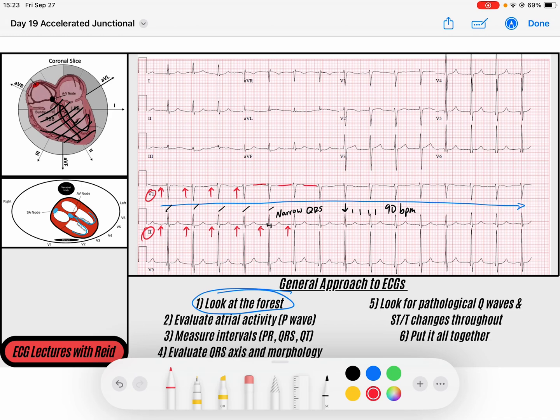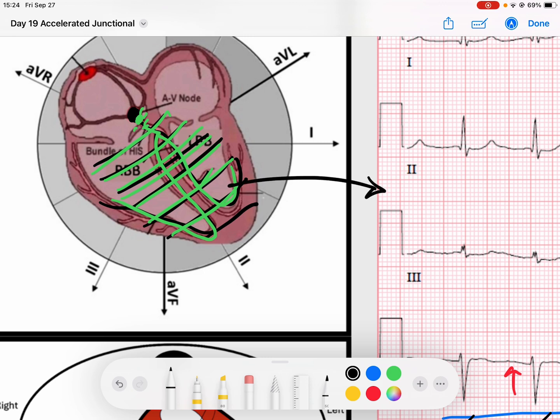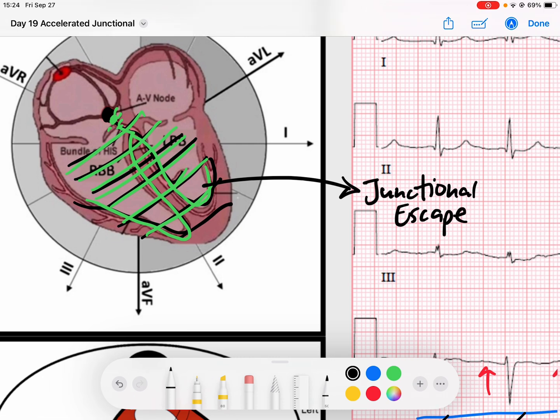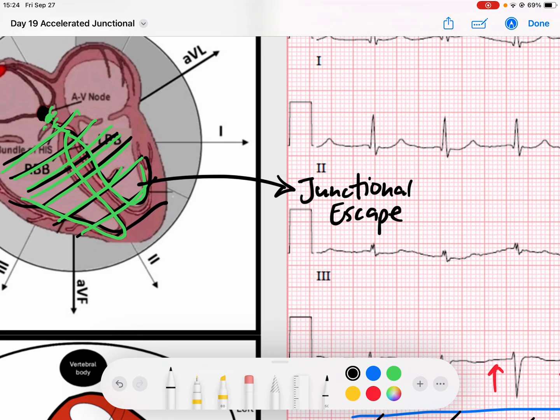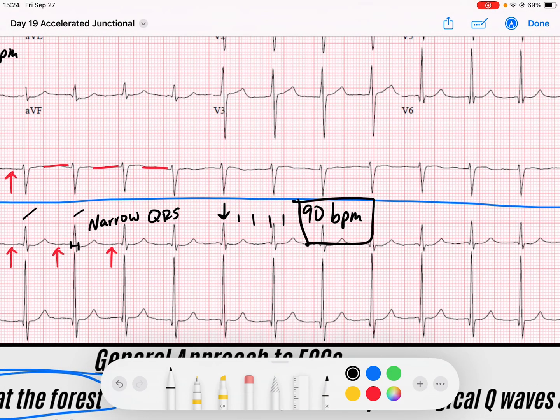I started to wonder if maybe this is a junctional rhythm. Junctional rhythms arise from the AV junction. A beat that arises from the AV junction sends signal down the His-Purkinje fibers in a normal fashion, creating a nice narrow QRS complex. We think of the junction as normally creating a junctional escape, because usually the AV junction doesn't take over a rhythm unless it has to — unless the sinus node has failed. Usually junctional escapes occur at a rate of 40 to 60 beats per minute. So this is definitely not a junctional escape, because we have a rhythm at 90 beats per minute.